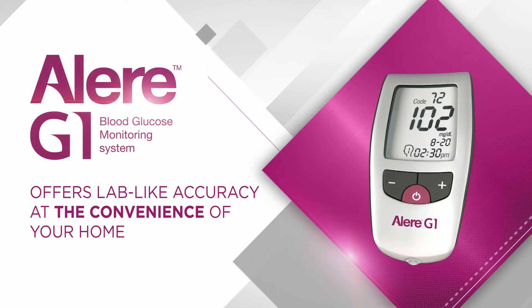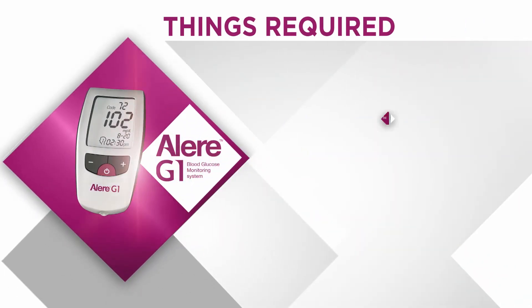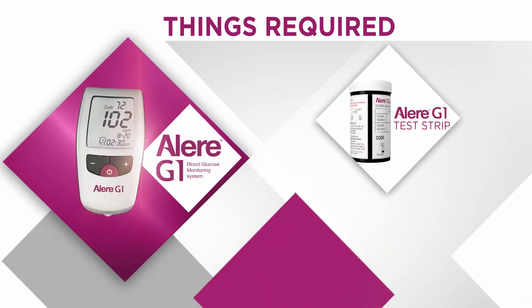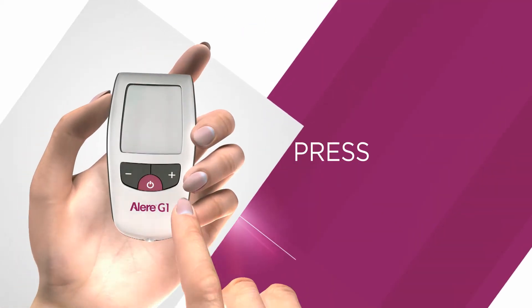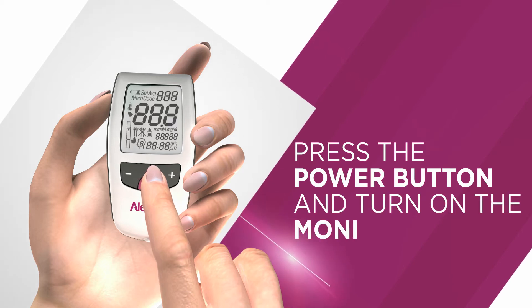You would need the following things: the Alere G1 blood glucose monitor, Alere G1 test strips, a lancing device, and lancets. Pick up your Alere G1 glucometer and press the power button in the center to turn it on.